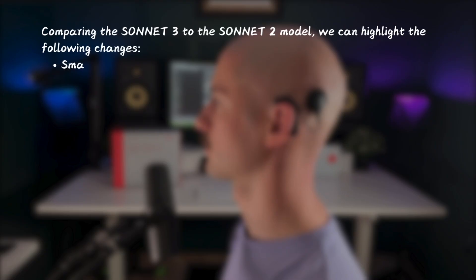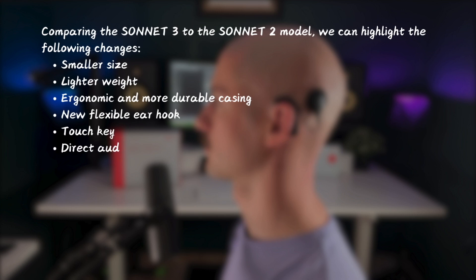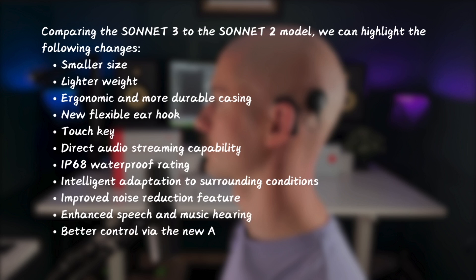Comparing the Sonnet 3 to the previous Sonnet 2 model, we can highlight the following changes: smaller size, lighter weight, ergonomic and more durable casing, new flexible earhook, touch key, direct audio streaming capability, IP68 waterproof rating, intelligent adaptation to surrounding conditions, improved noise reduction, enhanced speech and music hearing, and better control via the new AudioKey 3 app — especially useful for caregivers.